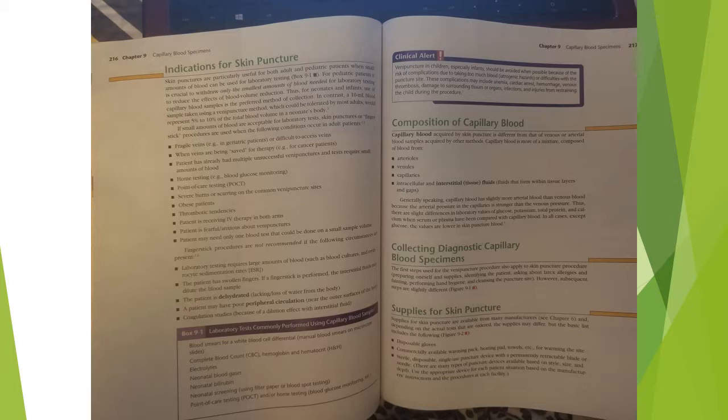Finger stick procedures are not recommended if the following circumstances are present. Laboratory testing requires large amounts of blood, such as blood cultures, erythrocyte sedimentation rates. The patient has swollen fingers. If a finger stick is performed, the interstitial fluid may dilute the blood sample. The patient is dehydrated, lacking or loss of water from the body. A patient may have poor peripheral circulation near the outer surfaces of the body. Coagulation studies, because of the dilution effect with interstitial fluid.